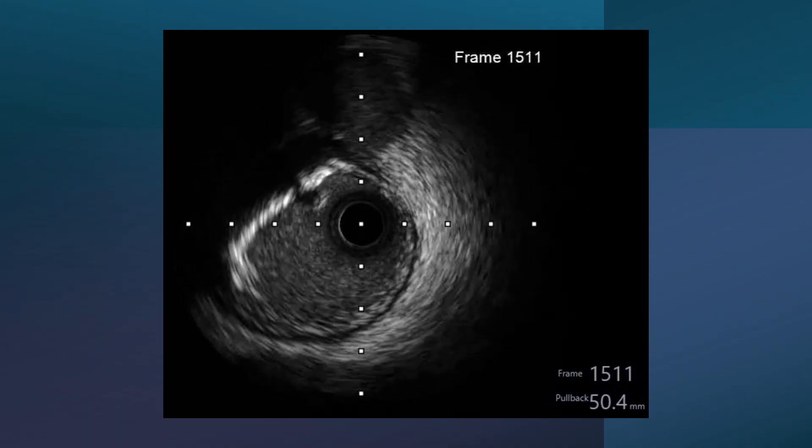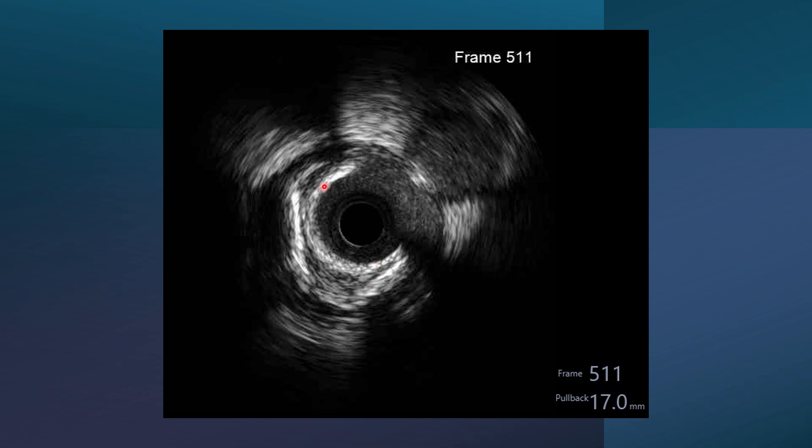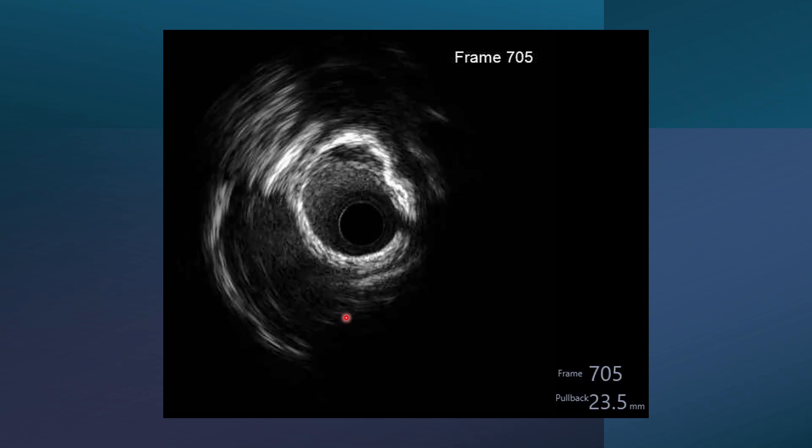Examining the IVUS more thoroughly, we can see at this part an arc that appears more than 80 degrees. However, this is rather fibrocalcific than purely calcific — it doesn't cast a lot of shadow. The calcium part here is superficial and intimal. The deeper part has calcium near the adventitia. This indicates that debulking by rotational atherectomy is not going to be very useful, especially since this calcium is only around 90 degrees or less. But at the mid part, we can see near 360 degrees of calcification, which is an indication for debulking.